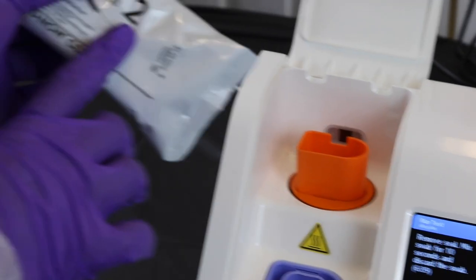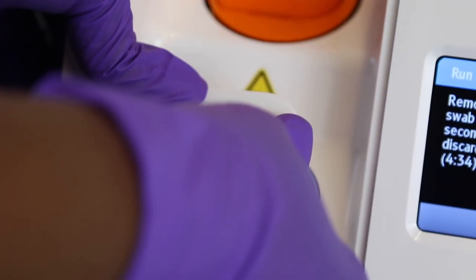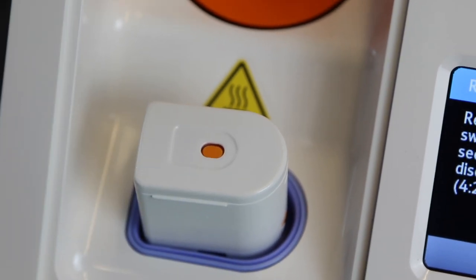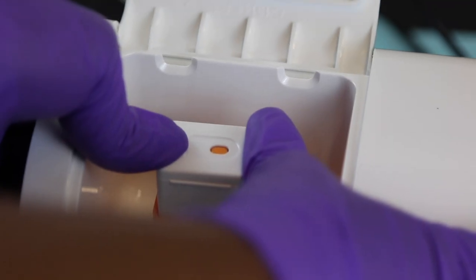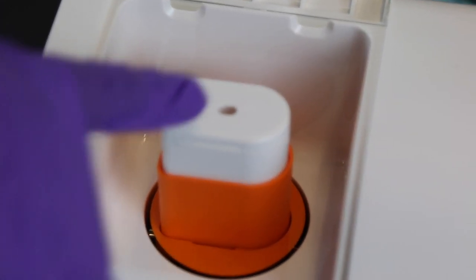Take your white cartridge from package two and make sure it's oriented correctly. Push it into the blue receiver. You must verify two things: you must hear a click and you must see the orange button pop up. If this does not occur, your test will be invalid. Then take the white cartridge out of the receiver and place it into the orange base as shown. You must hear a click and see the orange button go down — if this is not done, your test will be invalid.